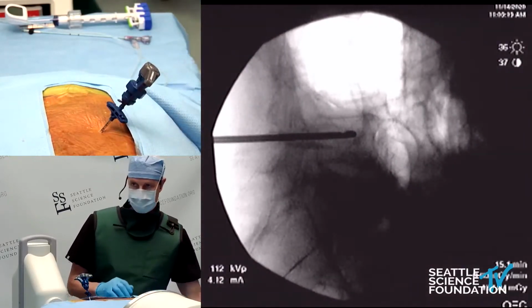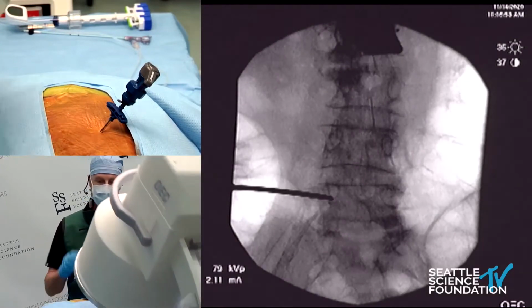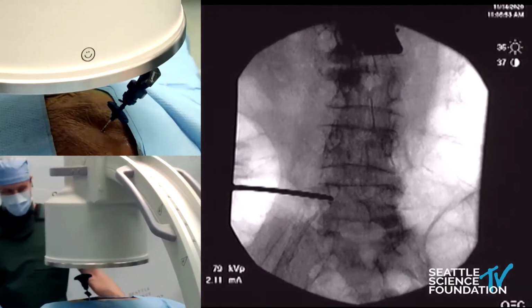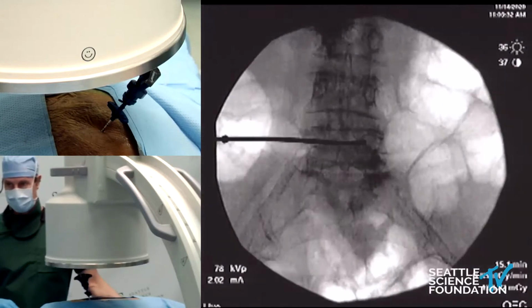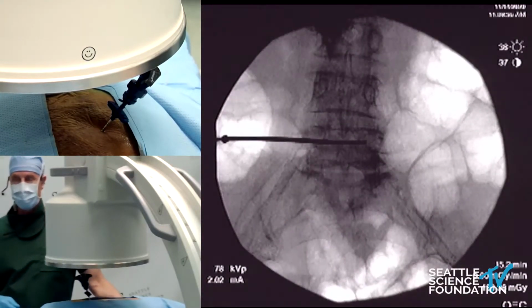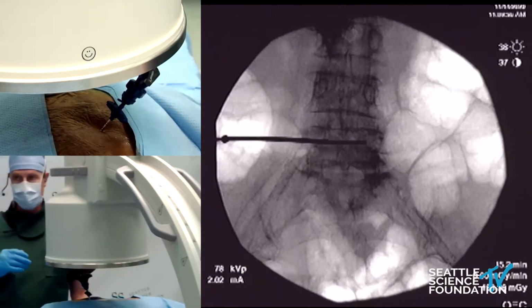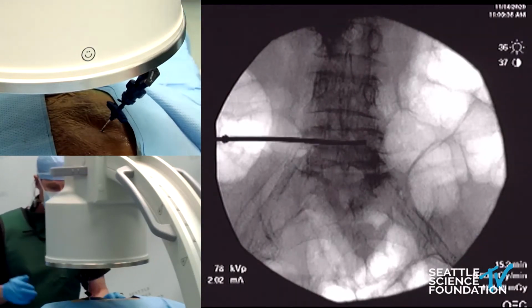And let's come back around AP. You can see that foreshortening upon itself. All that is the power curve curving to the opposite side of the vertebral body. The orientation of the Arcadia balloon is very medial lateral. And so we're directly across. In fact, we're all the way across to the opposite pedicle. So the orientation of the balloon will follow the orientation of the power curve, and it will be located exactly here on the AP and the same place on the lateral.